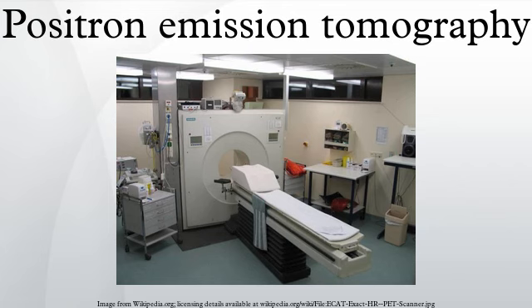PET technology can be used to trace the biologic pathway of any compound in living humans, provided it can be radiolabeled with a PET isotope. Thus, the specific processes that can be probed with PET are virtually limitless, and radiotracers for new target molecules and processes are continuing to be synthesized. As of this writing, there are already dozens in clinical use and hundreds applied in research.